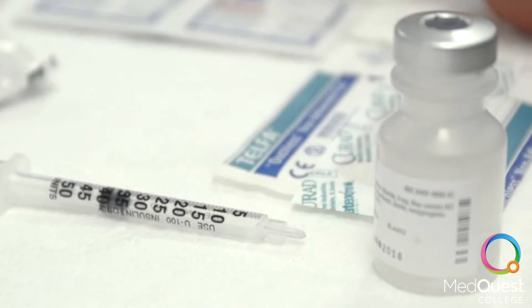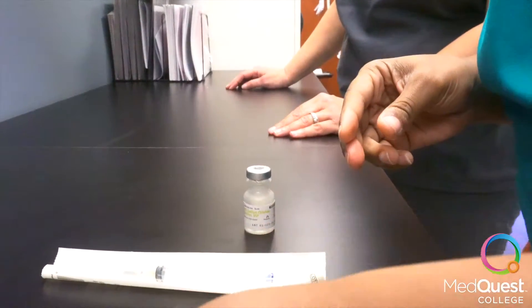First, we gather all of the supplies needed. Next, we alcohol the top of the medication vial.